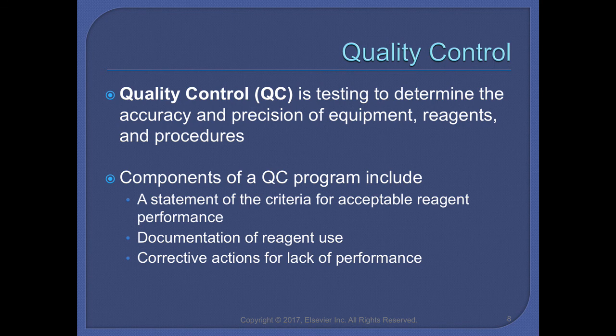So records of quality control testing must be maintained. So you have to keep all of the results, interpretations, the date of testing, and the identity of the personnel that actually perform the testing. So usually in the laboratory, what we'll do is we initial. For me, my initials would be CV.